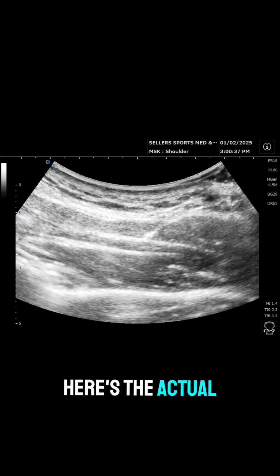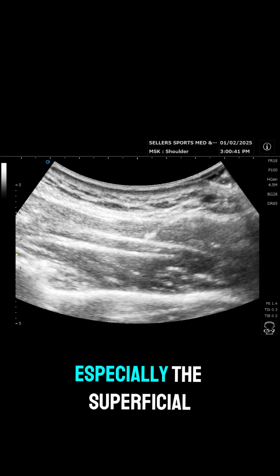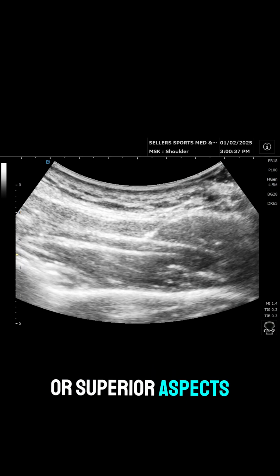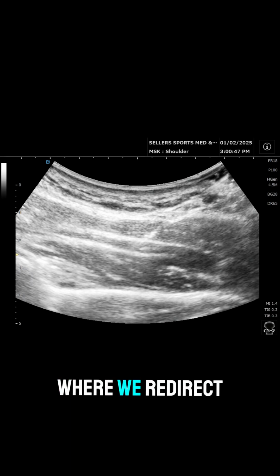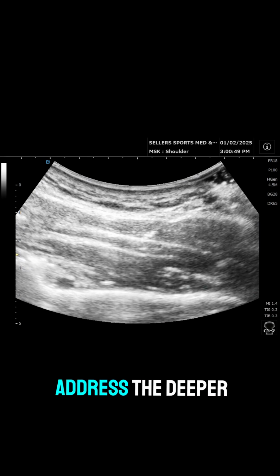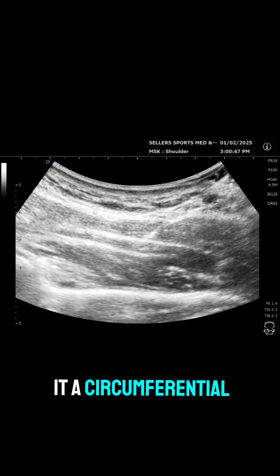Here's the actual procedure where we see that lidocaine bathing that nerve, especially the superficial or superior aspects of the nerve. Here's a continuation of the procedure where we redirect the needle and address the deeper or inferior parts of that nerve to really give it a circumferential lidocaine block.